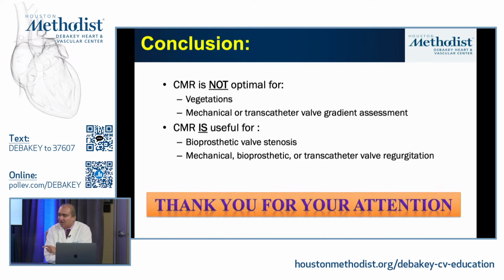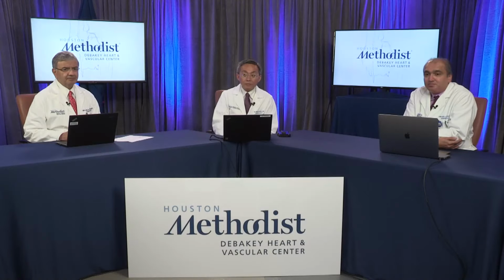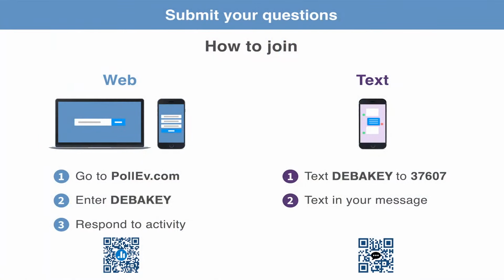So I'm going to turn it back over to Dr. Chang, and then you've also got kind of an algorithm that we have. So let me go ahead and turn the floor back over to Dr. Chang, and then we'll wrap up with this algorithm right here, which Dr. Chang will come back to. Yes, thank you. Can you guys switch over? I just have a couple more slides. We just show this. Okay, sure.